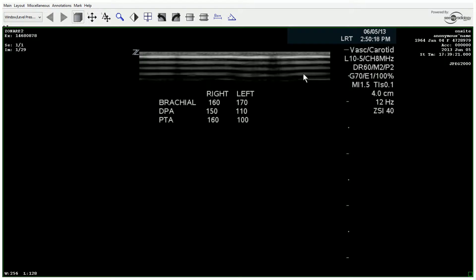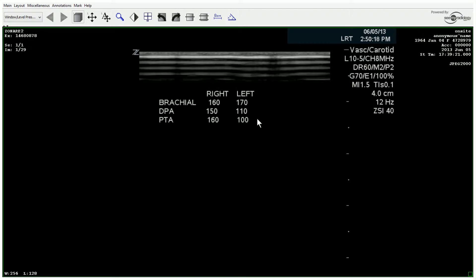Our next patient presents with a history of pain on the left side when walking. The sonographer starts out with ABIs after resting for approximately 10 to 15 minutes. From the pressures taken at the ankles bilaterally, you can already see what to expect: somewhat normal — actually very normal — pressures on the right side, versus decreased pressures on the left.